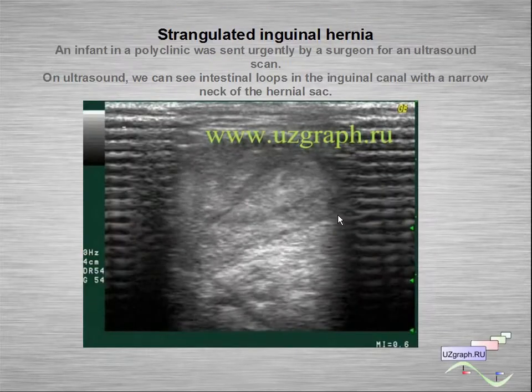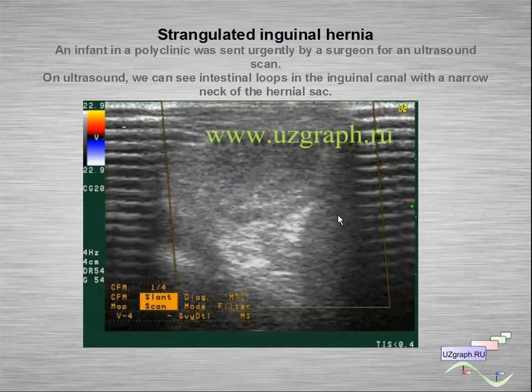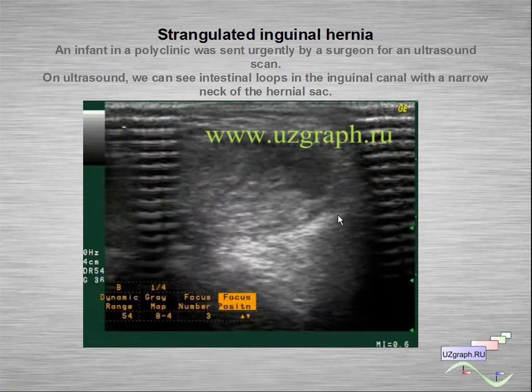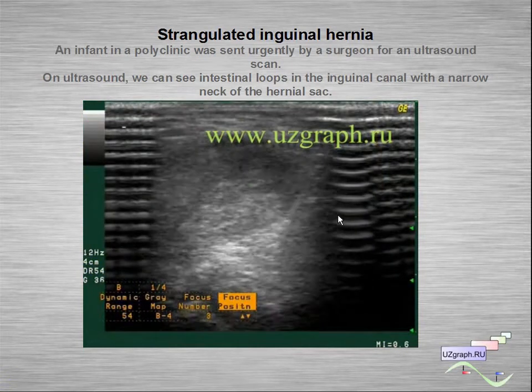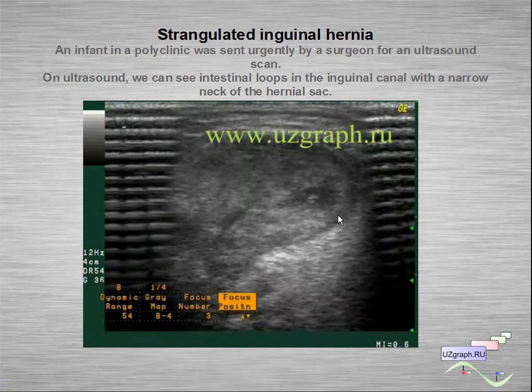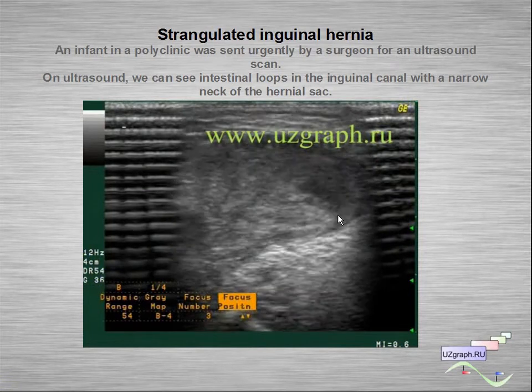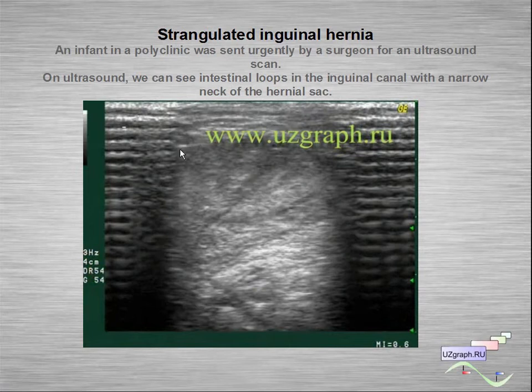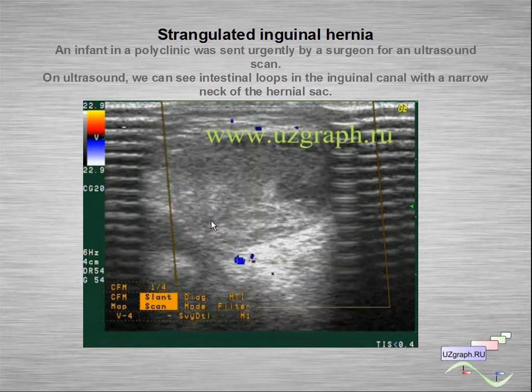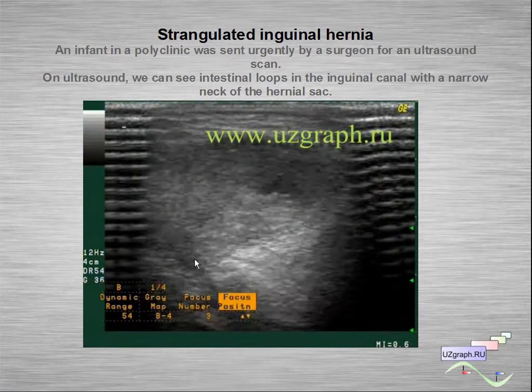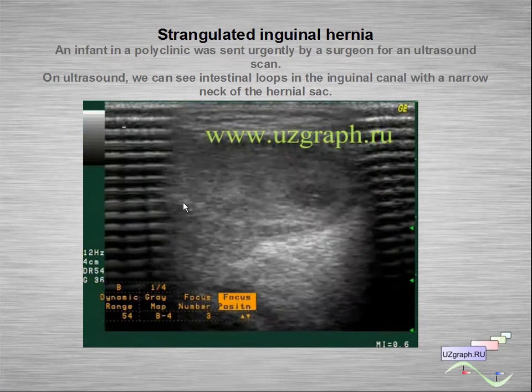Another case of strangulated inguinal hernia: an infant from a polyclinic was sent urgently by a surgeon for ultrasound. On ultrasound we can see intestinal loops in the inguinal canal with a narrow neck — you can see here the thin neck.